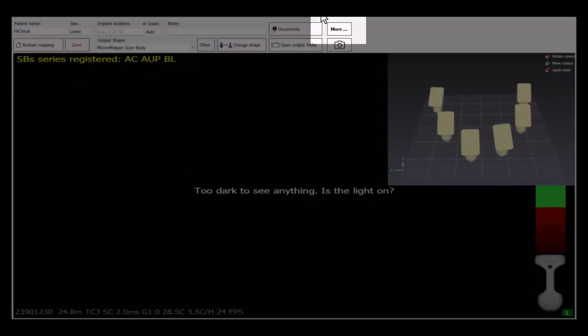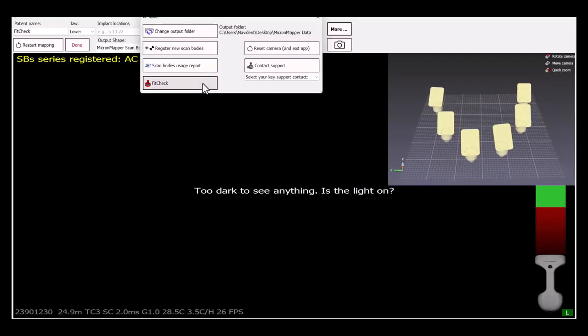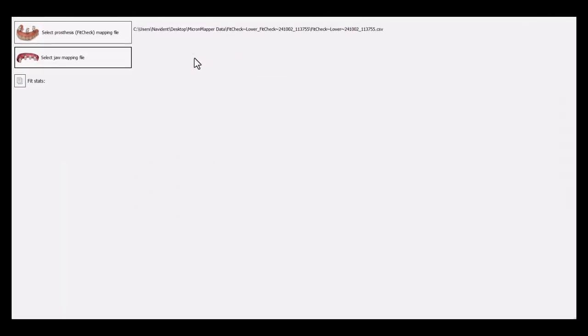After the scan is finished, click on More and select FitCheck option. Once selected, you will be prompted to choose two mapping files, one for the fit check and one for the jaw mapping.